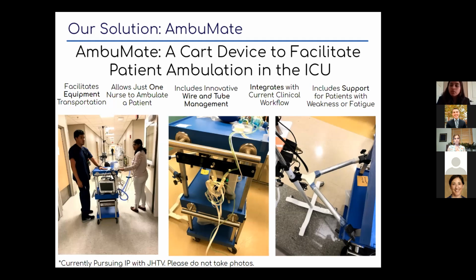We also did research on the chair that we have for patient support that can be taken out of the cart and sit stably on the ground. And we did research on the height of that chair and how that changes based on how old the patient is, how tall the patient is. And we found a size that really should work for everyone based on the research, based on the appropriate seating height and everything. And so the translation from the pediatric ICU to the general ICU should be actually fairly simple.